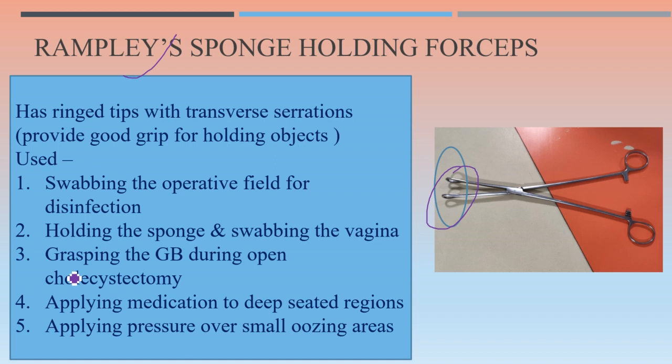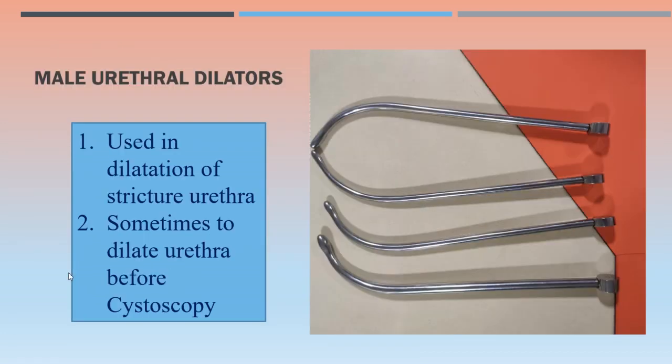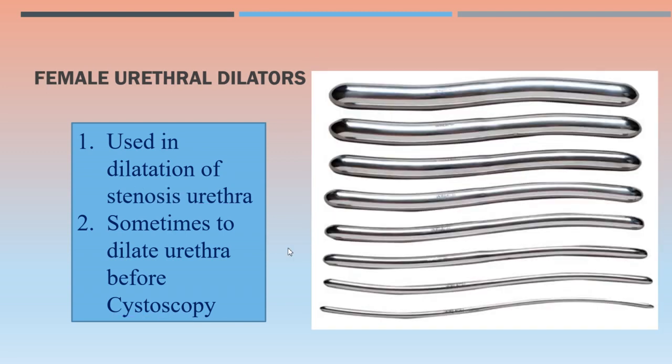These instruments are male urethral dilators, available in sets. They are used in dilatation of stricture urethra and sometimes to dilate the urethra before cystoscopy. Nowadays, a specific variety of male urethral dilators is also available through which a guide wire can be passed. These are the female urethral dilators.